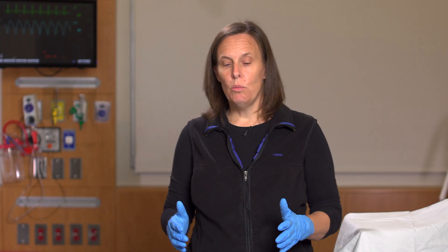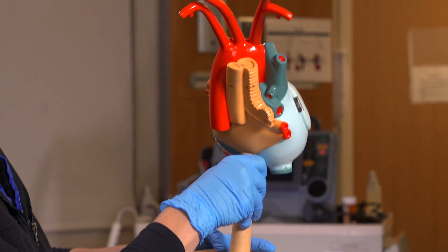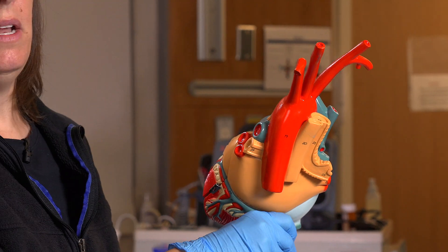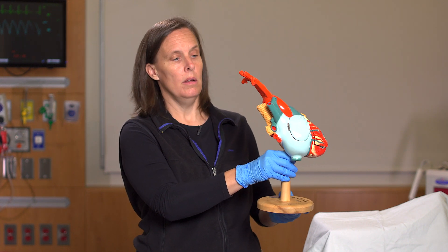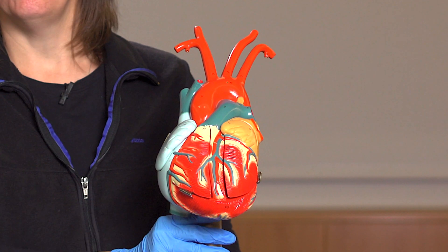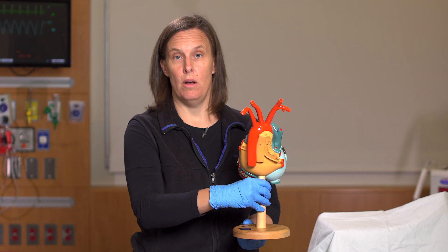Regarding the debriefing, we actually did a bedside debriefing and stayed in the actual simulation site rather than going to a conference room. This helped a lot for the learners because as the instructors were teaching skills on suctioning, cuff inflation and deflation, and basic tracheostomy maneuvers, it was very helpful to be at the bedside. We also had a 3D model that helped a lot in a review of basic anatomy with respect to bleeding from a tracheoanominate artery fistula. Even a 2D model would help — something to bring out during the debrief as a basic anatomic review of what's going on in this case.